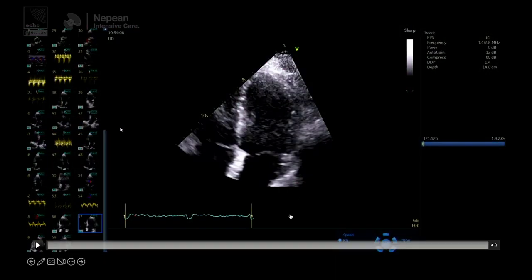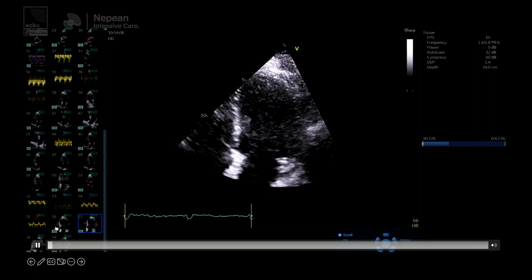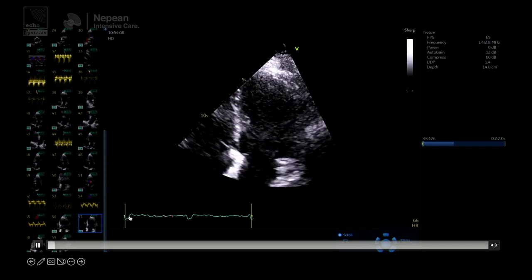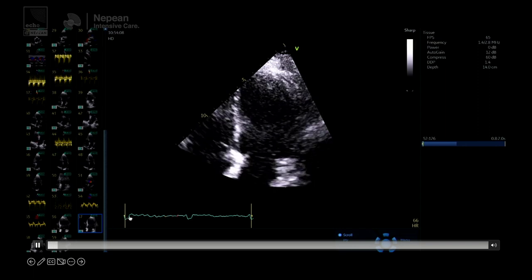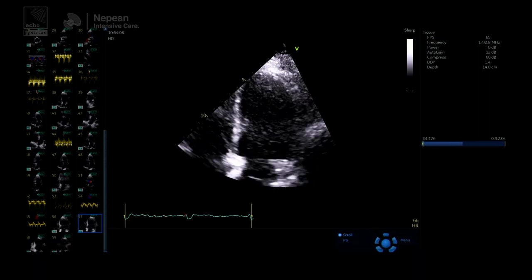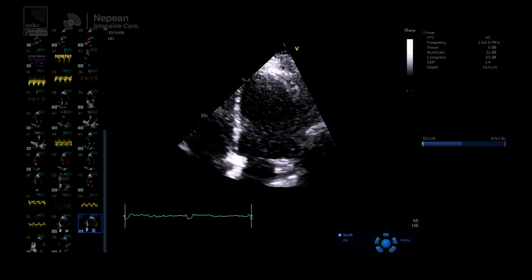Should we talk about how to do it first? We're going to be doing the Simpson's biplane ejection fraction. We have a video here — it's slightly long and not perfect by any means. Emma, do you want to talk through what Louise is doing here?